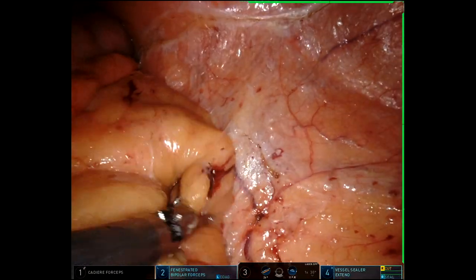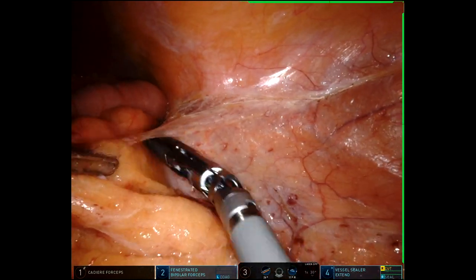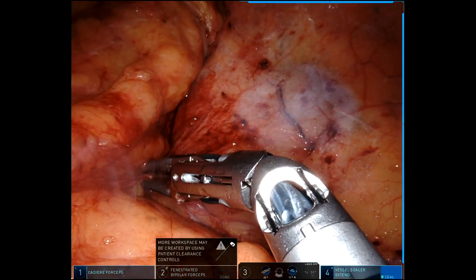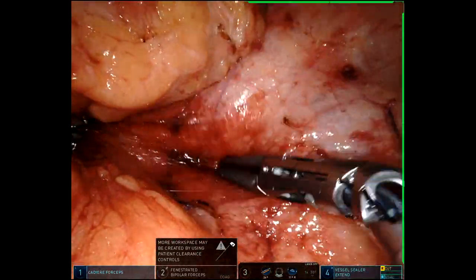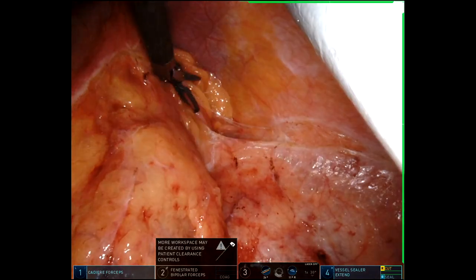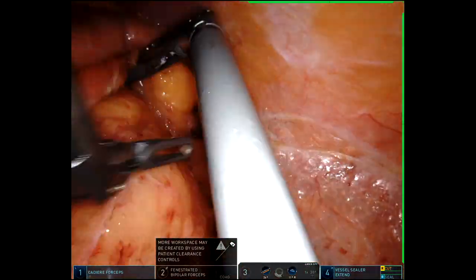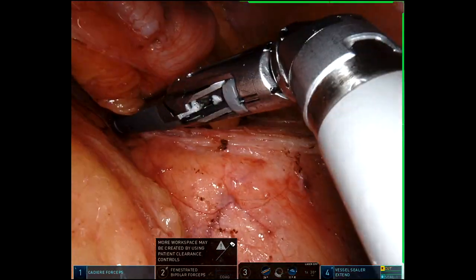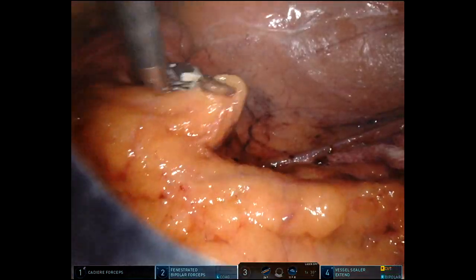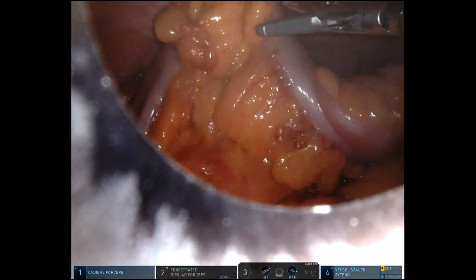I am a selective splenic flexure mobilizer, as you know from my videos. I'll go until I think I have minimal tension. With the port setup I have, despite being in steep Trendelenburg, if I needed to come out and around the flexure, I would have been able to do it without redocking or repositioning the patient. I'm nearly at the flexure right here — that actually was the spleen. I did not do a full mobilization, but I am assessing my tension and feel like I've got really good length.